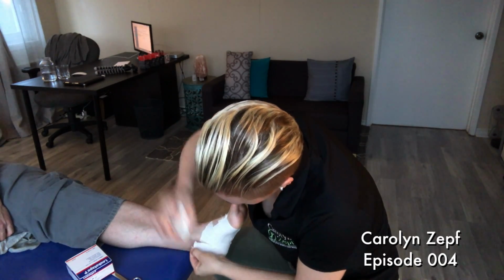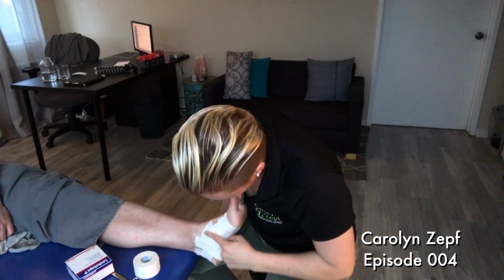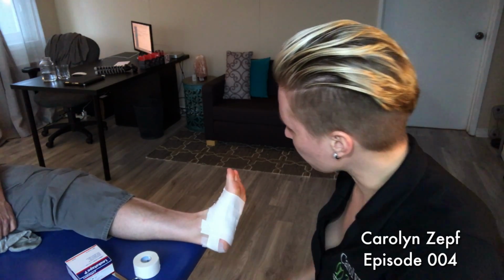Good, and you pull it all the way to the heel. There should be a small portion of the heel still showing out there. So you can see that medial surface is covered. The inside of the foot is being pulled upwards.